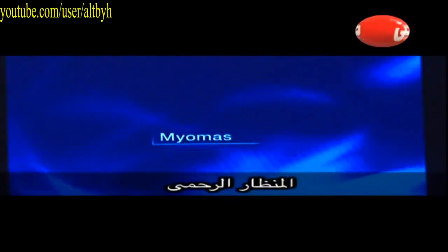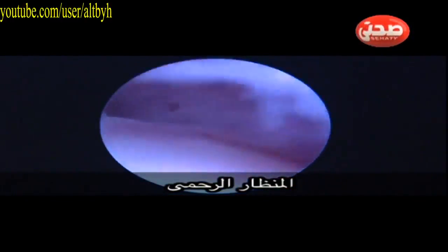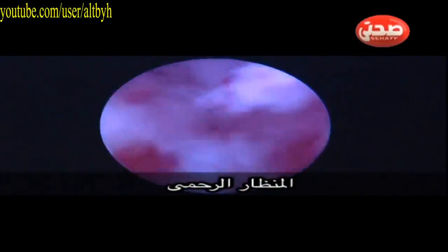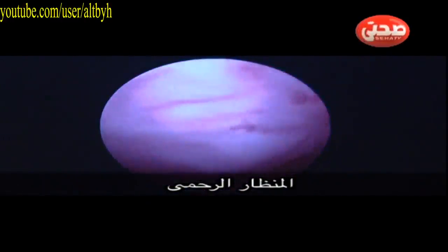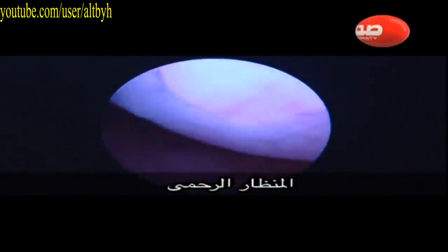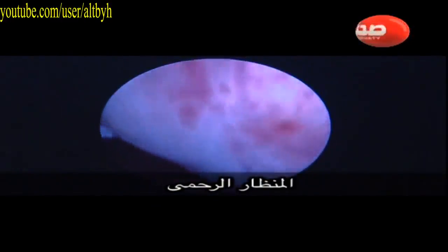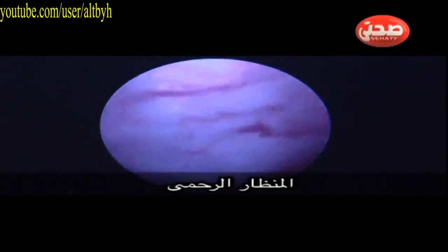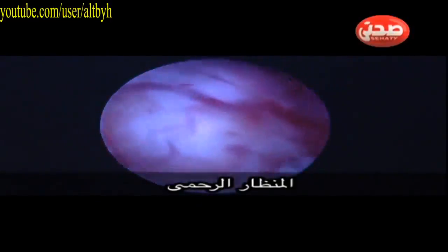Also, you can find myomas, which, like in this case, you have a look inside once you are in the cavity, and you can find a large submucous fibroid, like in this case. You can see the peripheral vascularity, which is very characteristic of the myomas.